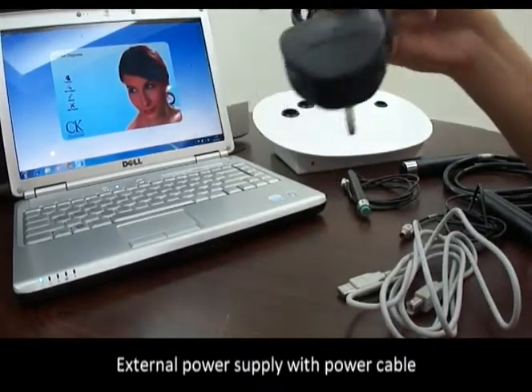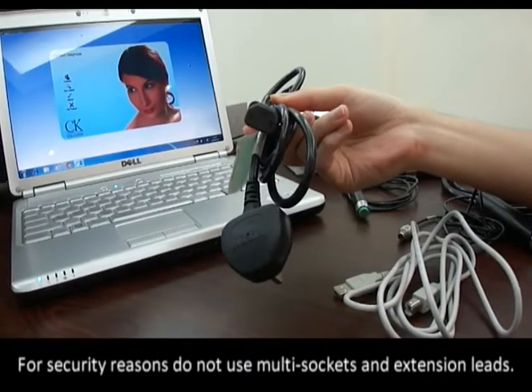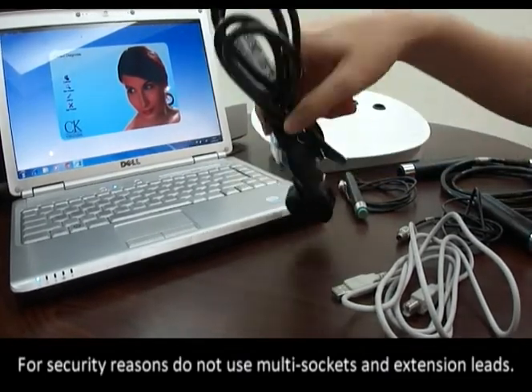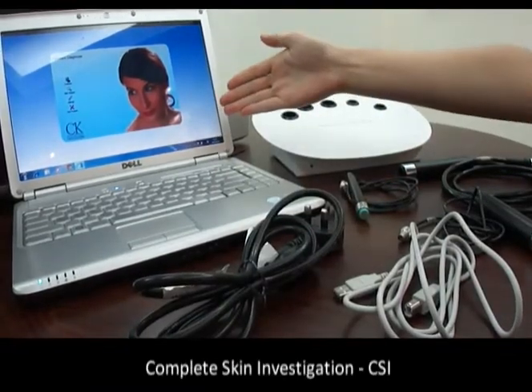An external power supply with power cable is provided. For security reasons, do not use multi-sockets or extension leads. Also included is the software: Complete Skin Investigation, CSI.